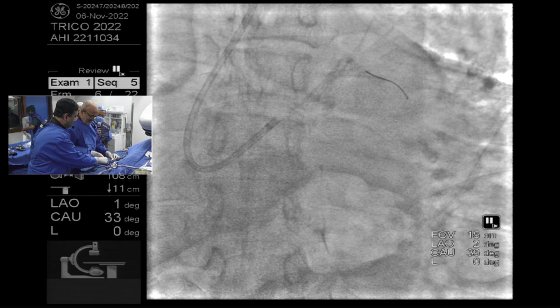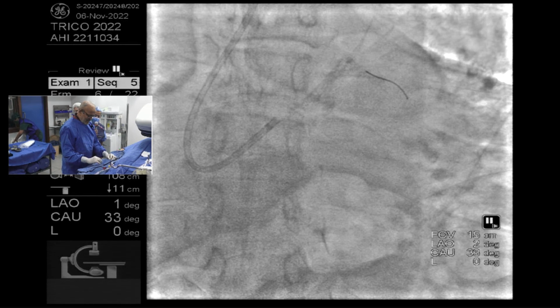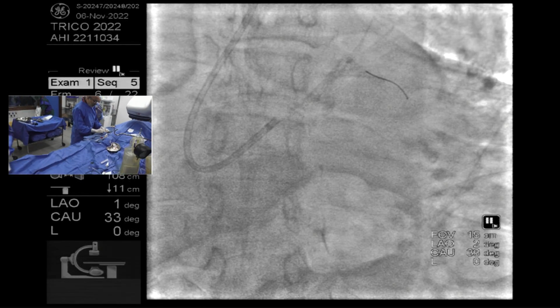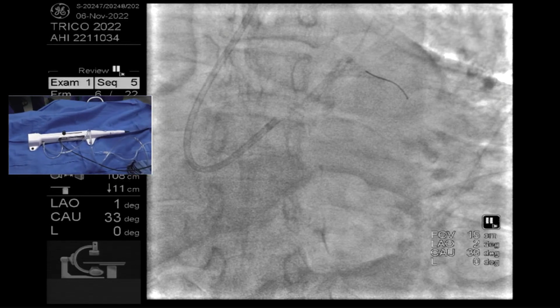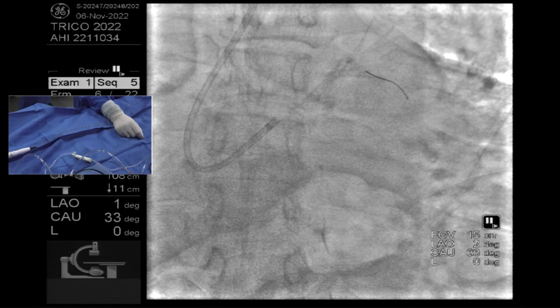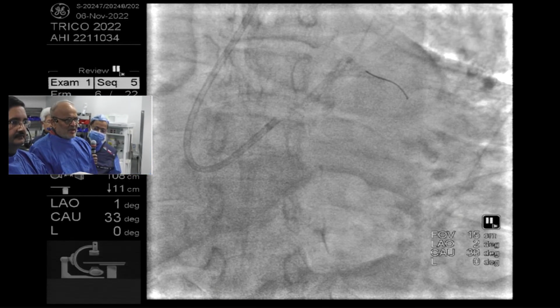So what you do have in the solution, you have prepared by your own. Can you go over the formula, the regimen again? The rotor flush is 500 ml of normal saline, which has 5,000 units of heparin, 500 micrograms nitroglycerin, and 5 milligram diltiazem.